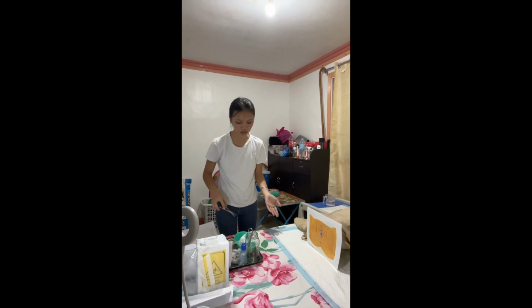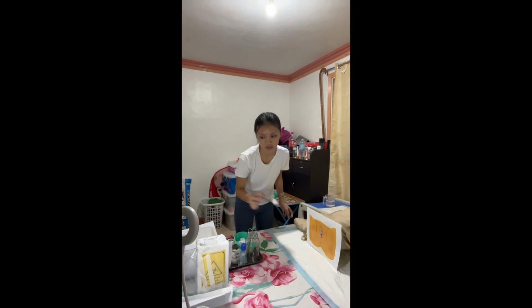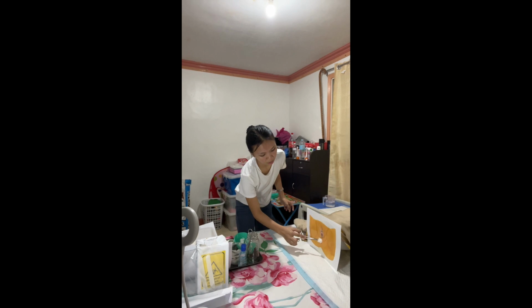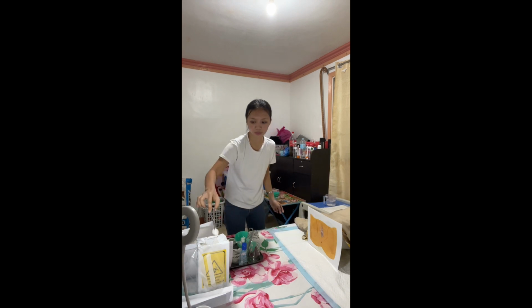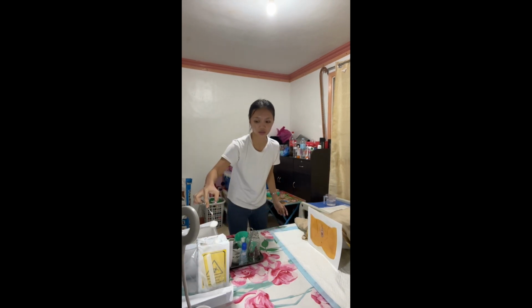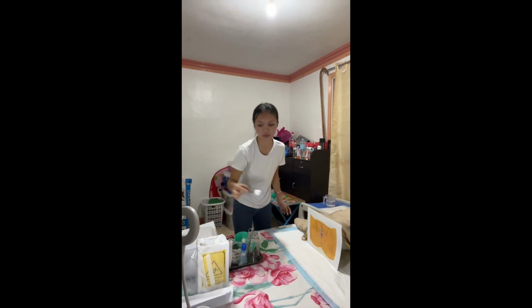We are going to cleanse the genital area starting from the symphysis pubis to the anus, and then discard it. Next is mons pubis to the external labium. Next is mons pubis to the external labium and then to the internal labium. Then discard, and then to the other side.